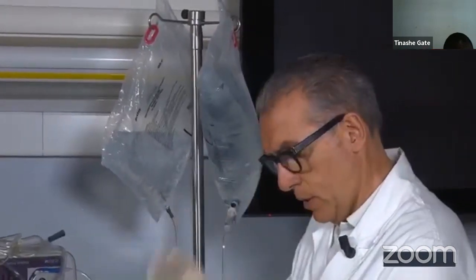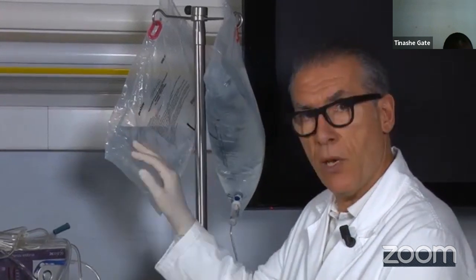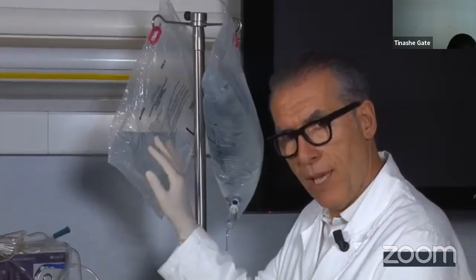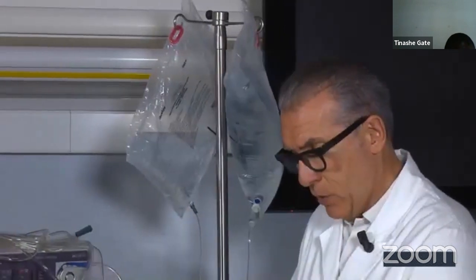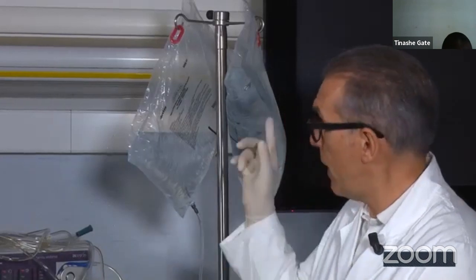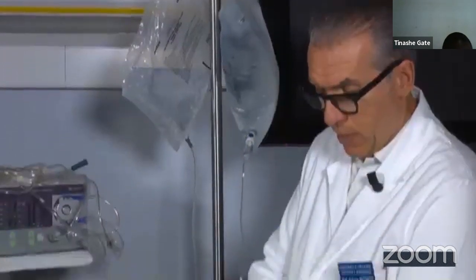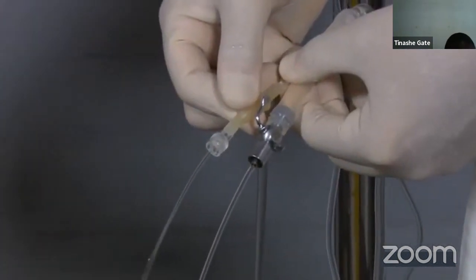So this is an important concept. As soon as the amount of liquid decreases, if you use only gravity pressure, the amount of liquid inside the sac will generate a different flow. And at the end of the story, a 5-liter bag and a 2-liter bag offer mostly the same amount of liquid, the same flow.